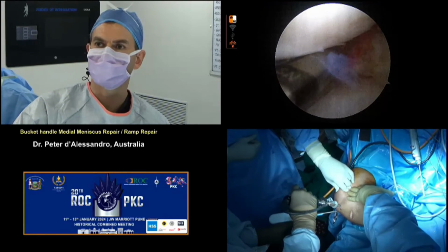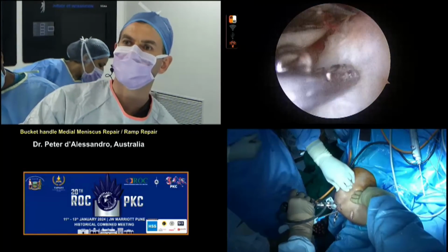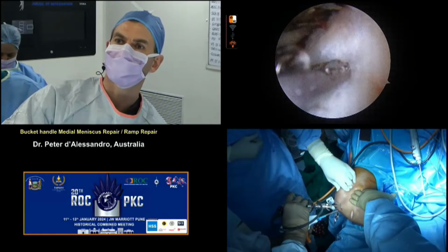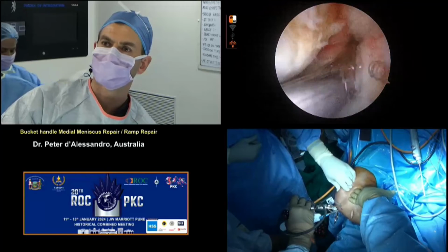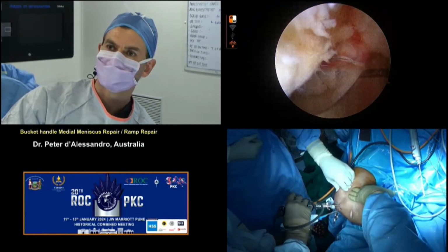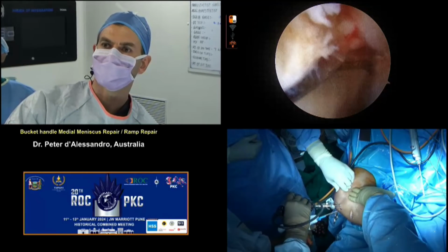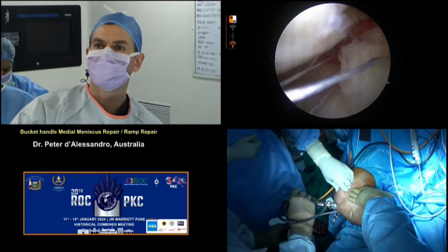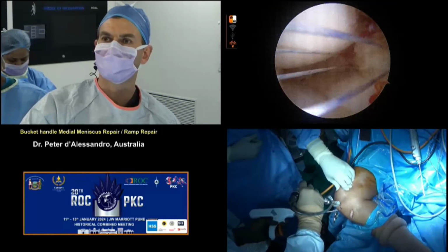And we've got a moderate bite there. And the beauty of this device is you don't have to then come out of the knee. I'm going to then move across here, and this is always the hard part, as we come across to this root component. And then we're going to hope that that hasn't passed in a horizontal component of the tear. And so far it looks like we're looking okay here for our side-to-side component.